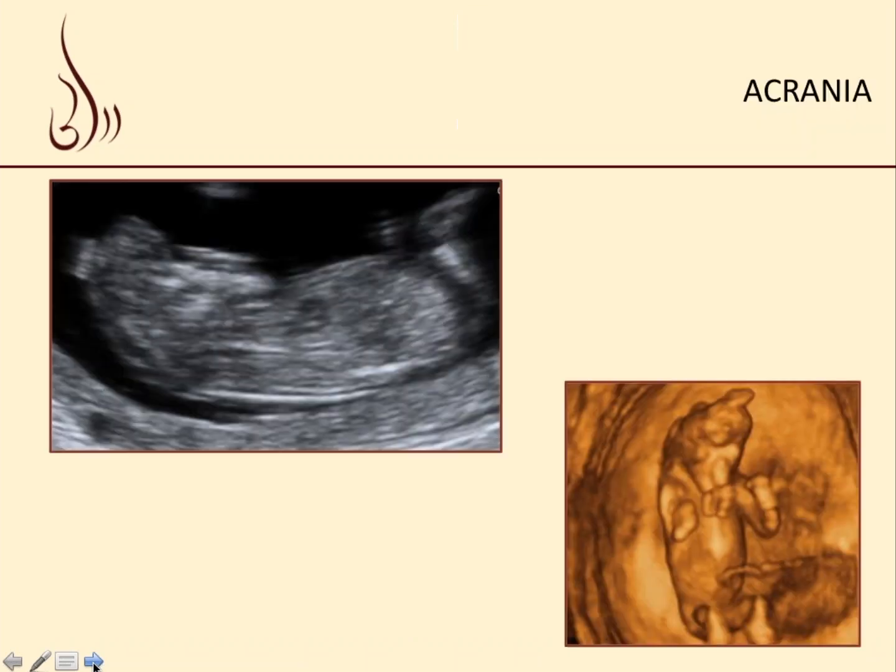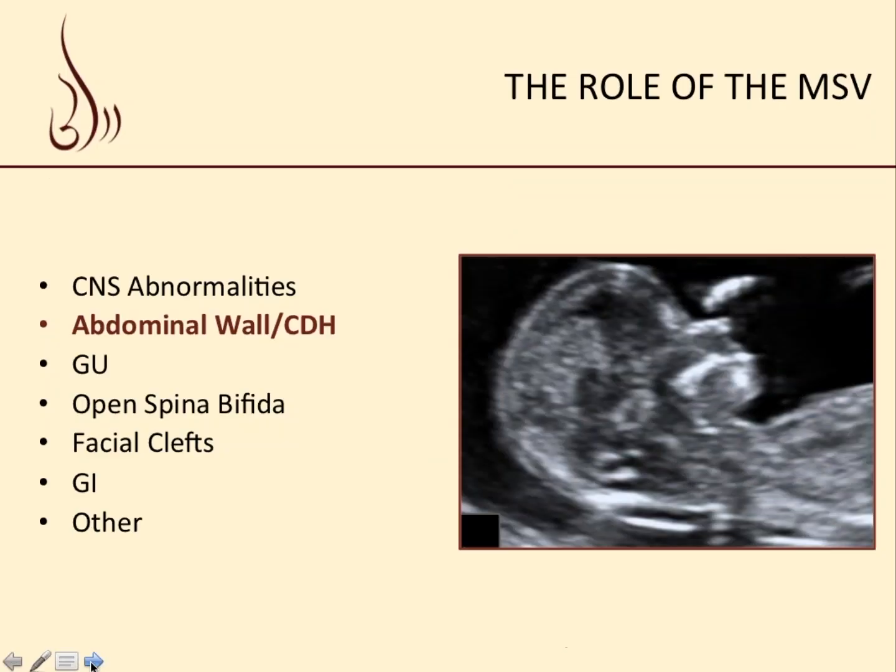And so as you're just trying to get your CRL and get that midsagittal view, you should be able to suspect acrania from the absence of the cranium and the irregularity as we see here. We definitely do not need 3D ultrasound to diagnose acrania.